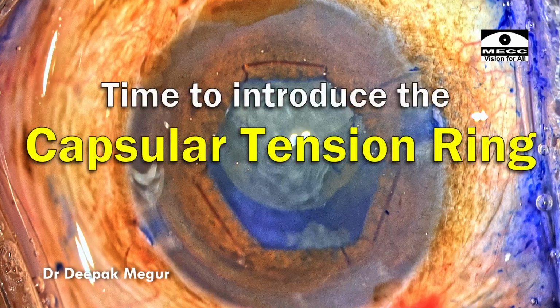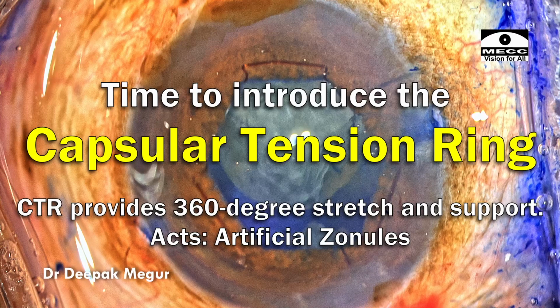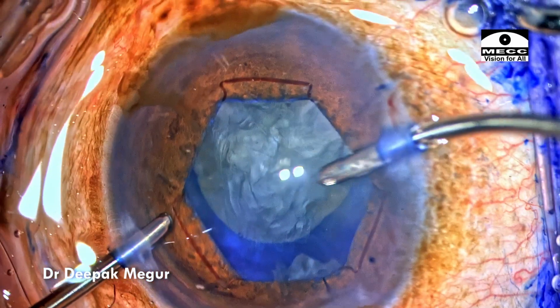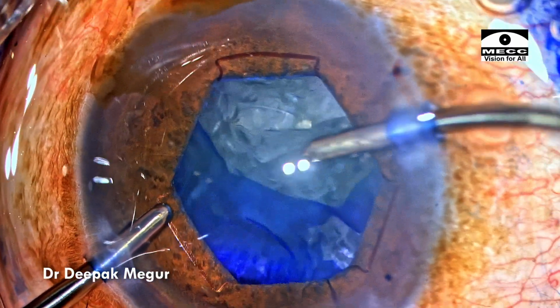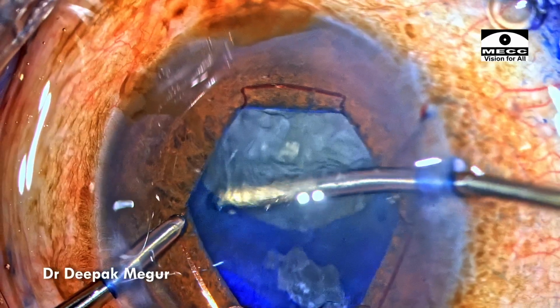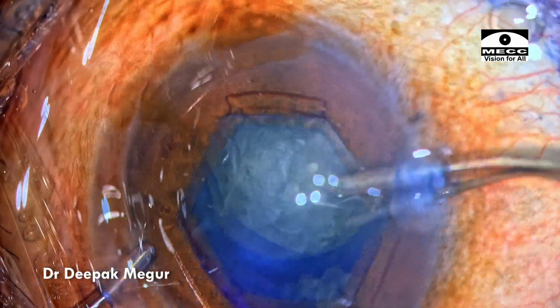So I thought this is the time for me to introduce the CTR, which is going to provide me 360 degrees stretch on the capsular bag and also act as an artificial zonule, providing some strength to the capsular bag as the nucleus manipulation is being done. So before that, I usually would like to aspirate some of the cortex so that there is space created within the bag. It's much easier to insert the ring.